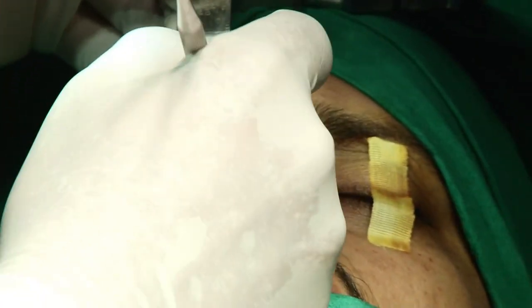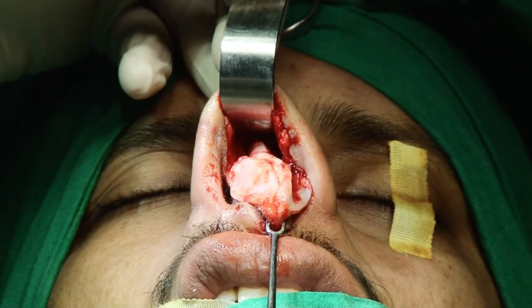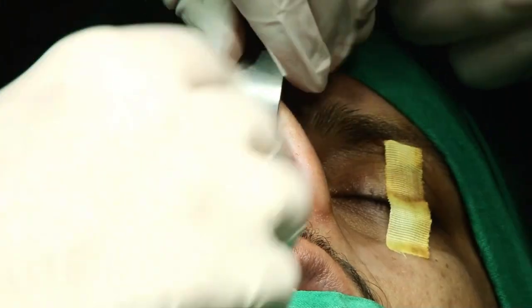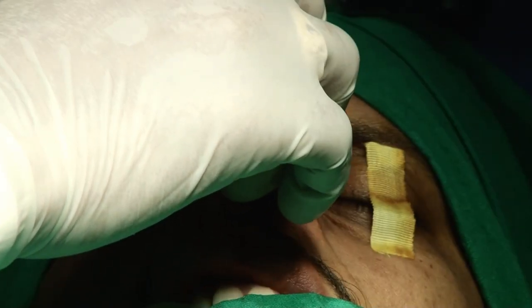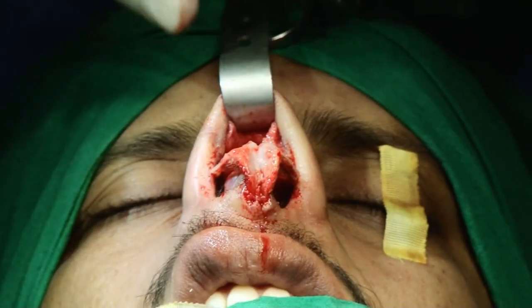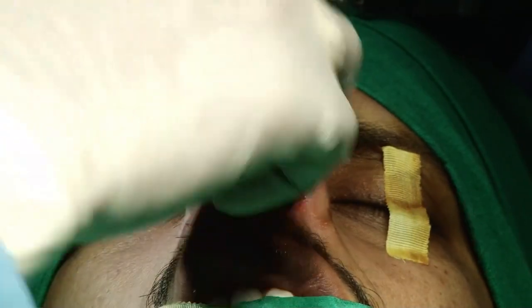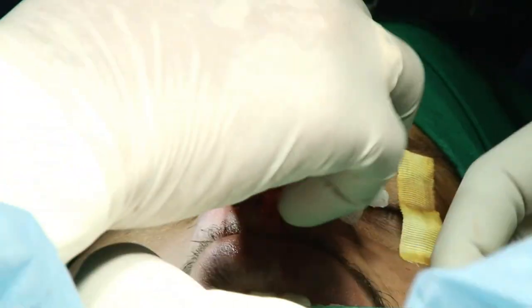Now put the self-retaining retractor. So we usually put this self-retaining retractor. It's a very good instrument by Rajin Sarkar. So then there is no need to hold it. We just fix it on the forehead by the teeth, and so this is the self-retaining one, okay?